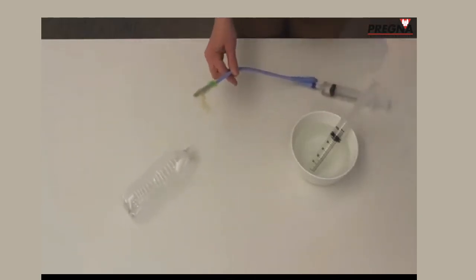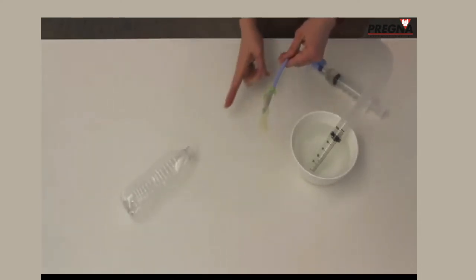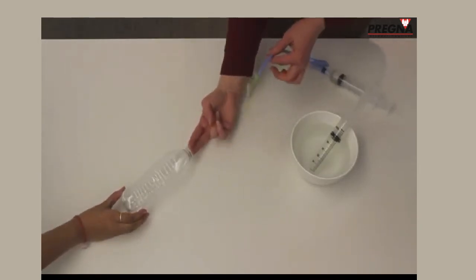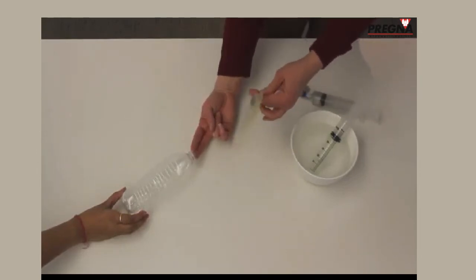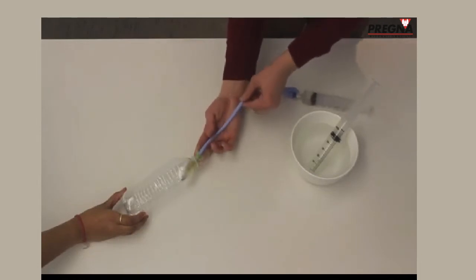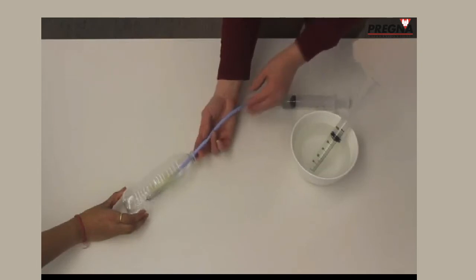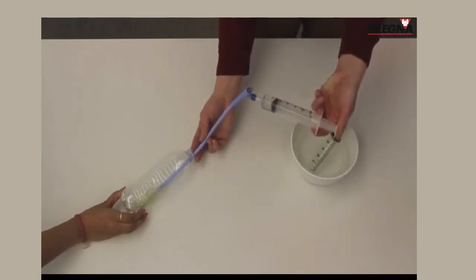Using the manual approach, perform a vaginal exam and place your two fingers in the cervix. Hold onto the uterine balloon by the Foley, not the condom, and slide it along your two fingers so it goes right into the opening of the cervix — this pulls the whole condom right up inside. Slide it all the way to the fundus and hold it in place. Since you have already filled the syringe with 15 cc of liquid into the Foley balloon, push that in and remove the syringe.